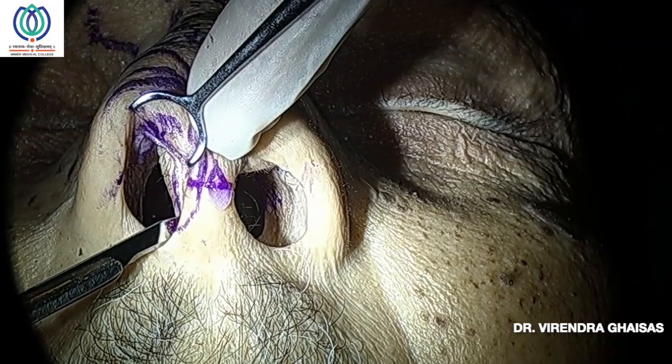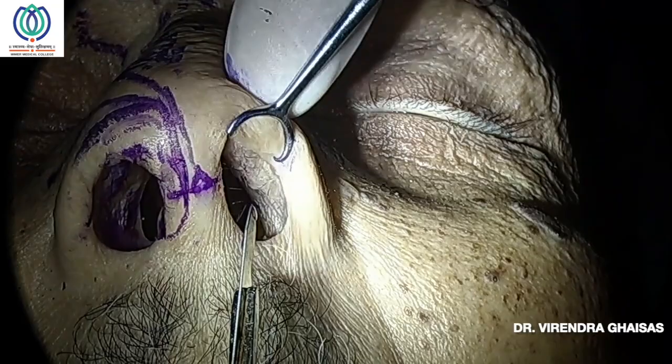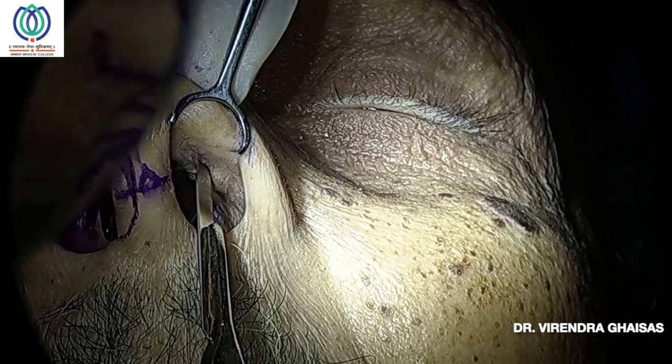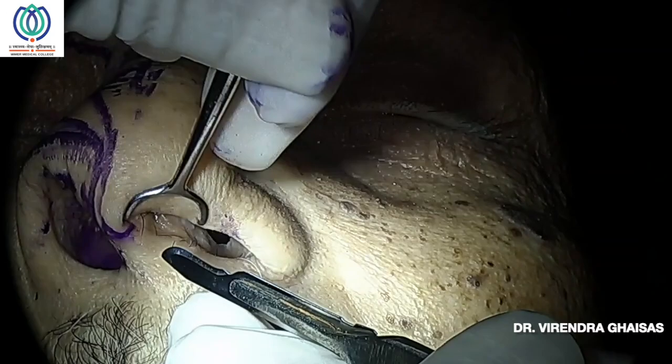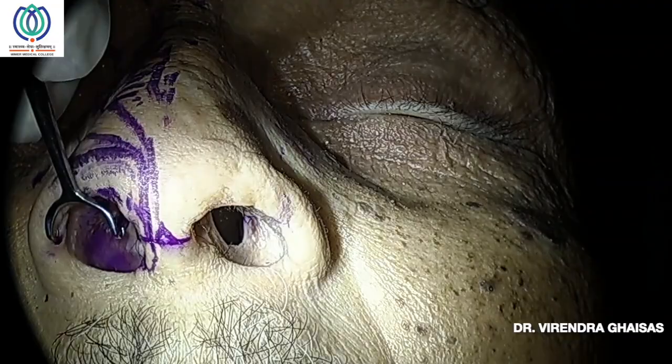In case you do an injury, you should know how to suture it precisely, either with 5-0 or 6-0 PDS. There are two ways of dissecting this skin envelope. Either you come from lateral to medial: you take the infracartilaginous and marginal incisions, dissect the skin envelope from this cartilage to avoid an injury, and then you take a columellar incision. This is one way.